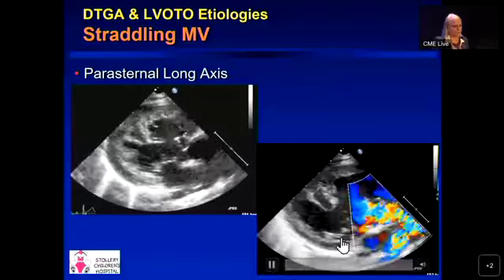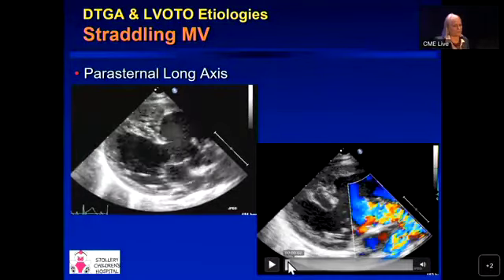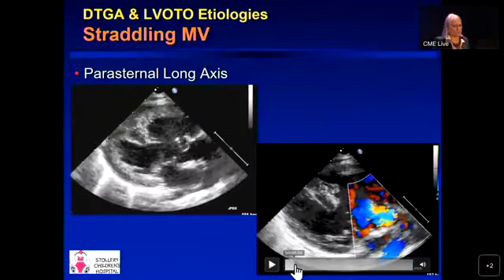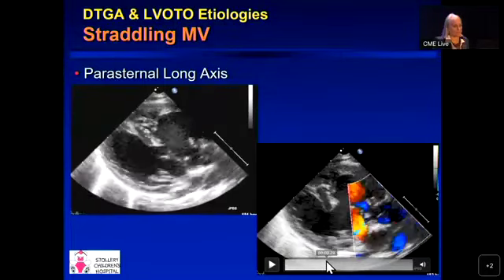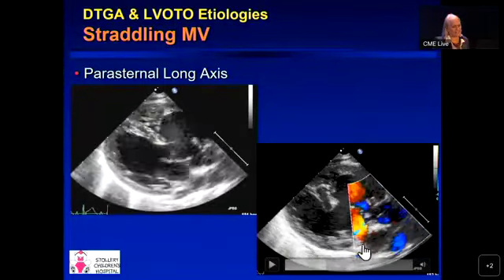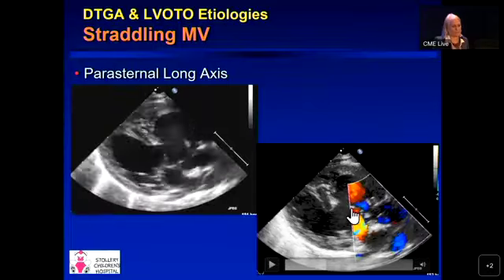So a lot of turbulence, but I'm going to just stop it. Like I said, this is the only problem with not doing your own slides, is you don't really have any control of what you get. And my colleagues were really, really busy giving me slides. So it's hard. This is LA. This is actually through the mitral valve.